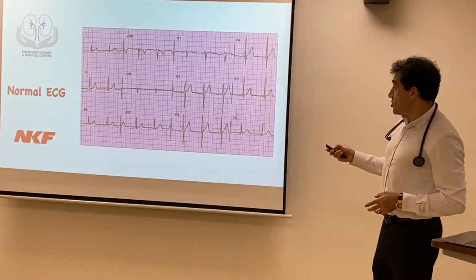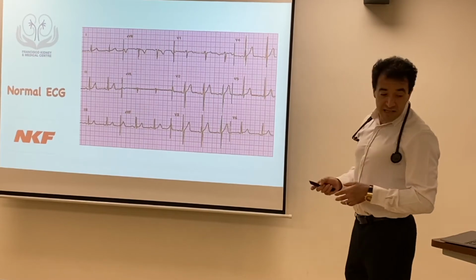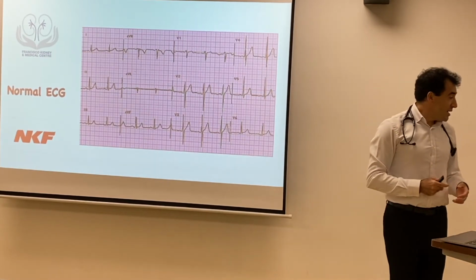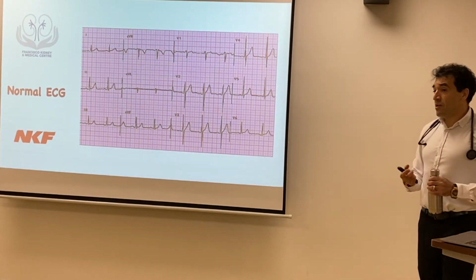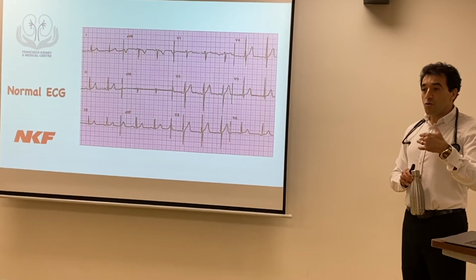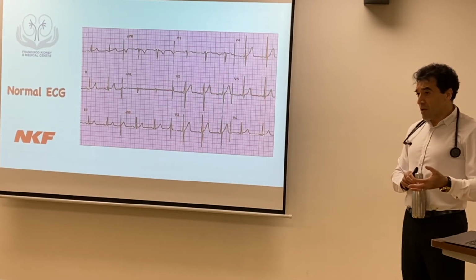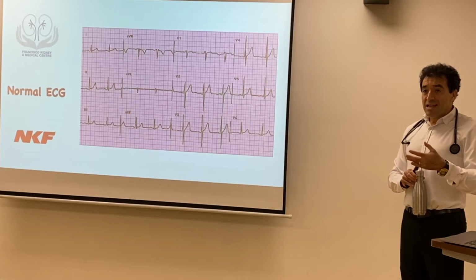If you have any question, just interrupt me. This is the normal ECG. It is very important that you familiarize yourself with the normal ECG because, yes, you can go systematically through ECG readings, but pattern recognition is also very important.